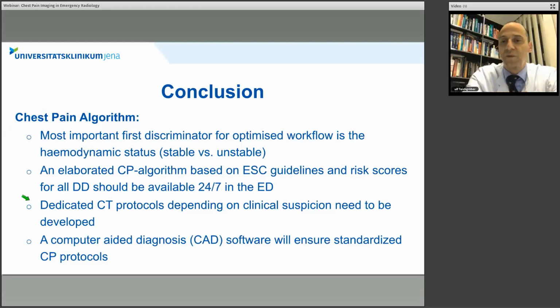One question was, do you always stay at 4 milliliters per second? No, actually 4 milliliters per second we are using for the dual rule-out or triple rule-out protocol. And for the coronaries, we actually go for 5 milliliters per second. And we usually take 350 or 400 concentration of the contrast media. One of the two. Usually we are taking 400 if available.